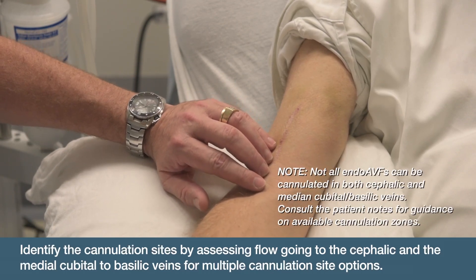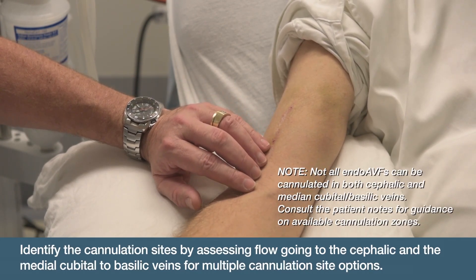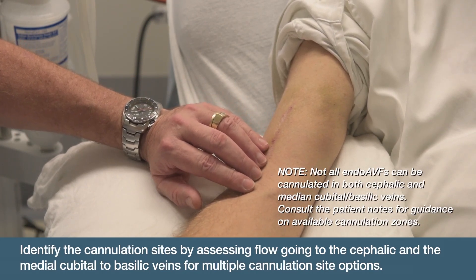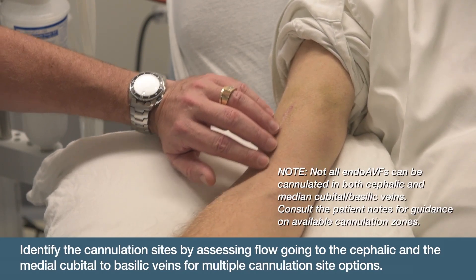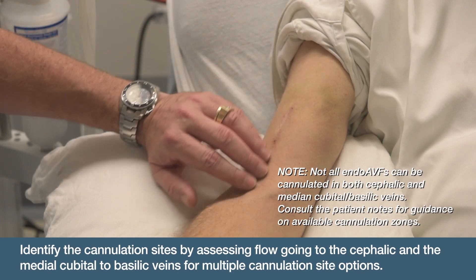There are different areas that you can actually cannulate, and with this fistula here, people have been cannulating the cephalic vein.